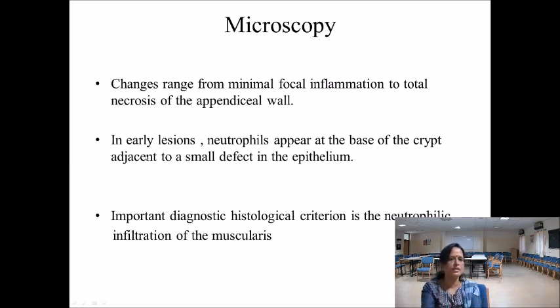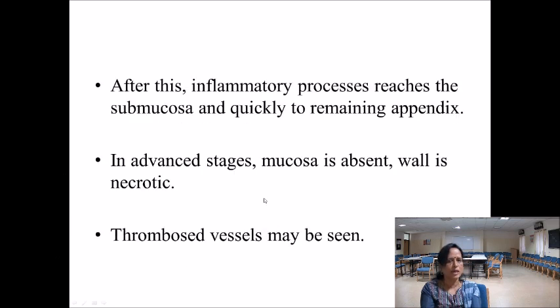Okay, it's time for us to see the microscopic appearance. From the serosa, the inflammation can extend on to the mesoappendix, the fat also, and the inner layer, that is the mucosal layer, could be ulcerated.